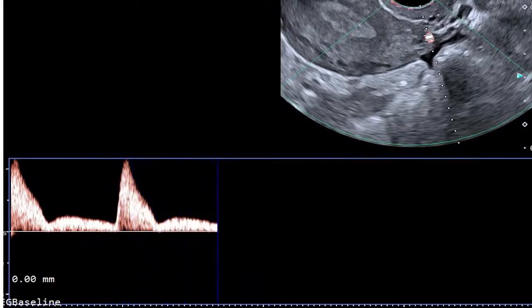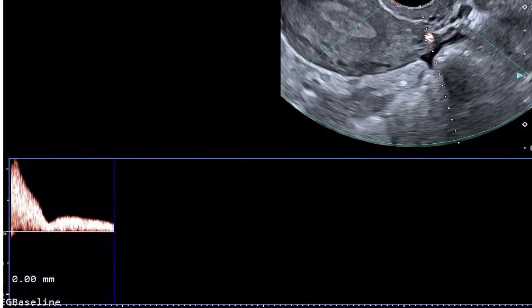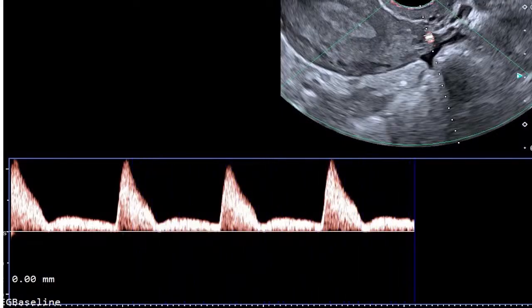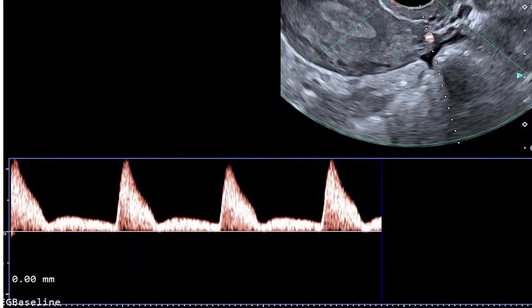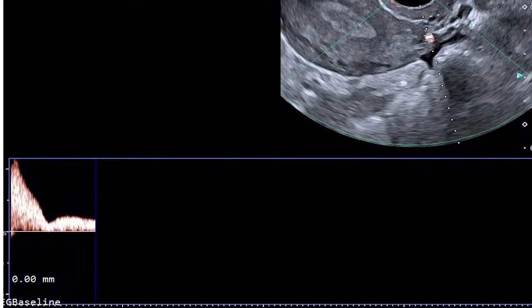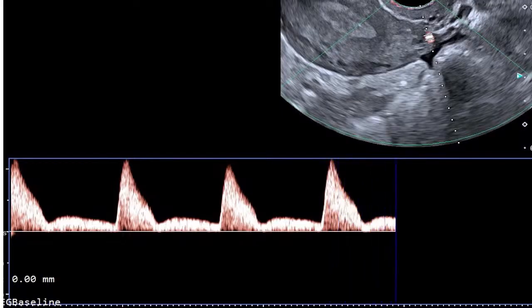Did you know that the uterus has a pulse that determines fertility success? Most people overlook the importance of blood flow, but the uterine Doppler is the revolutionary tool that measures exactly how receptive the lining is, which can help to determine fertility.